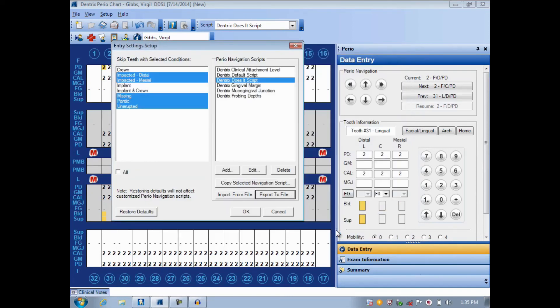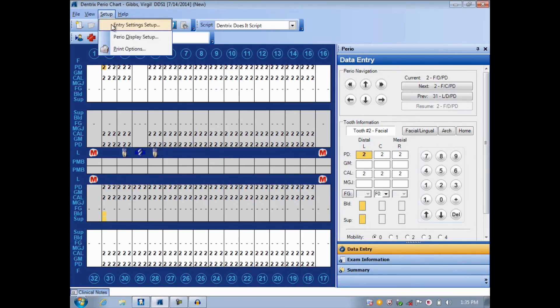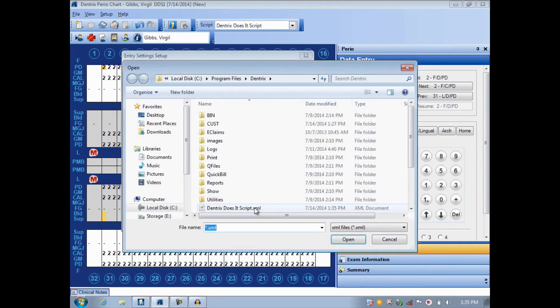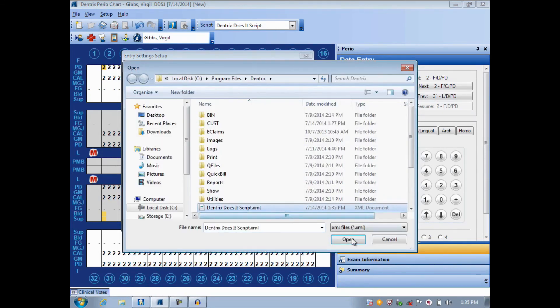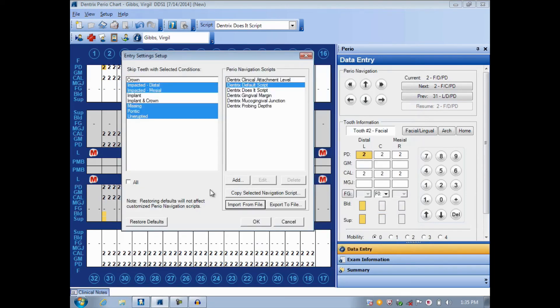Then I would go to the next computer, open up the Perio chart, open up Setup, Entry Settings Setup, and I would Import from File, and I would load that file back in. I'm not going to do that on this computer because it's the same machine, but that would cause the script to duplicate onto the next machine.